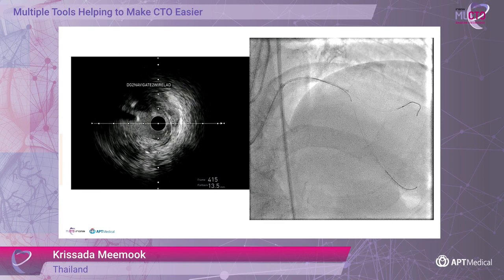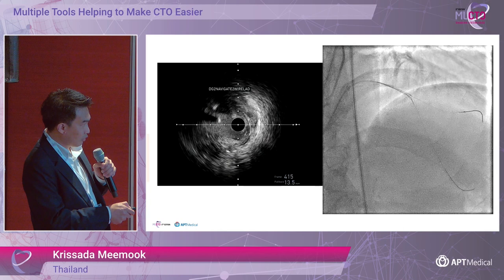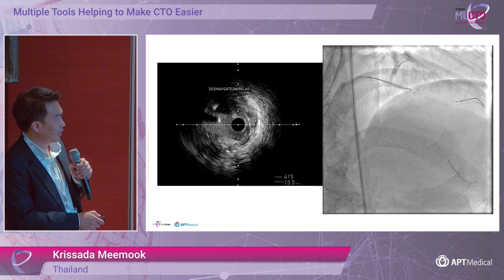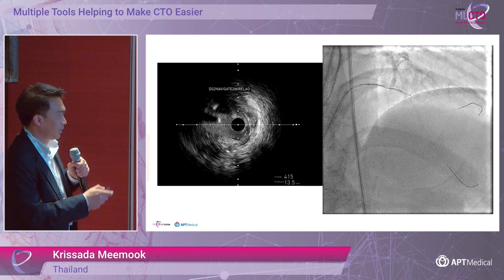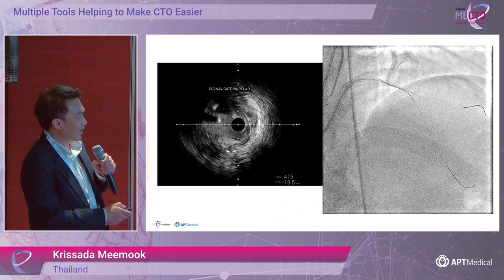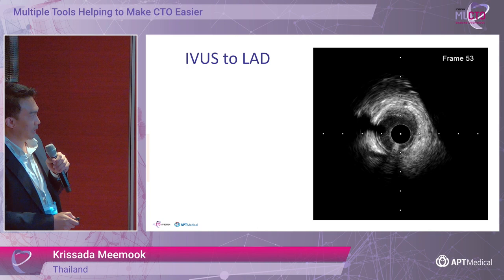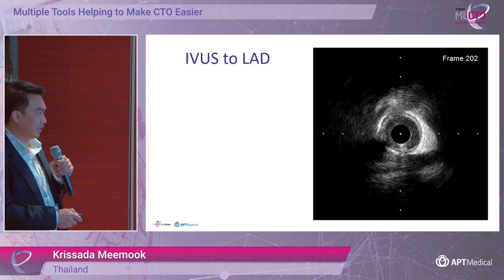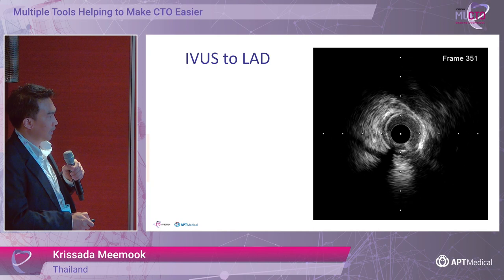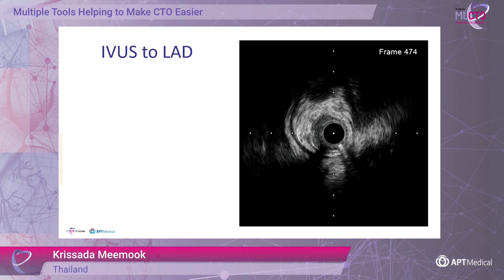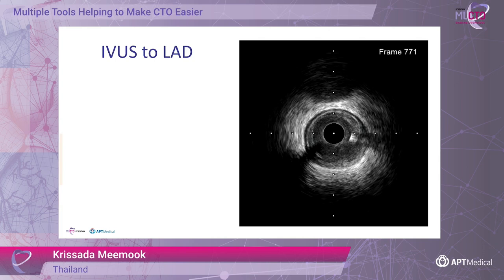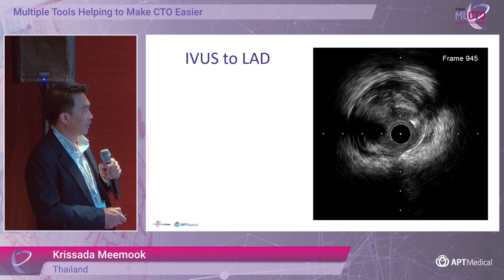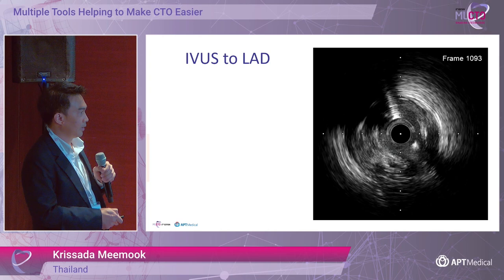You can see the wire movement as I tried to bring the Pilot 50 to the septal side of the LAD. Now we went to the septal side of the LAD — this is in the true lumen. We performed IVUS from the new wire, and you can see the distal LAD is in the true lumen. When we pull back to the mid-LAD, you can see the previous wire in the very large subintimal space, but the new wire is in the true lumen all the way from the distal LAD to the proximal LAD. Now the LAD wire is in the true lumen.